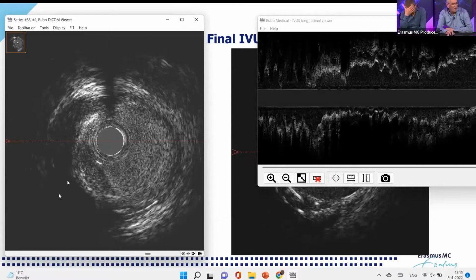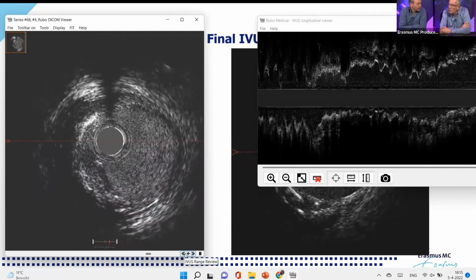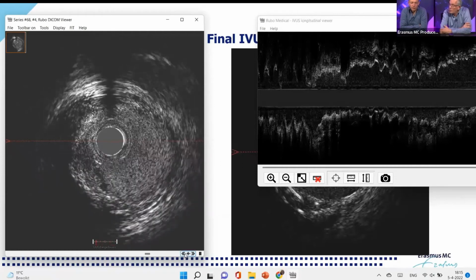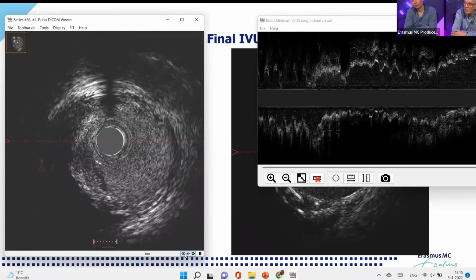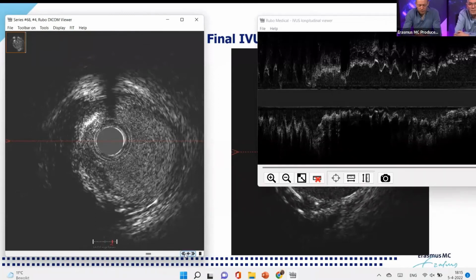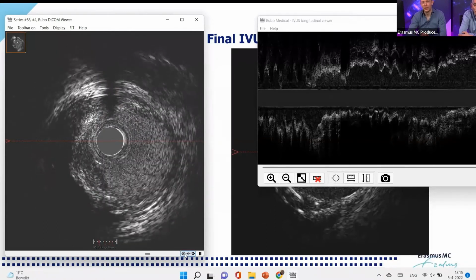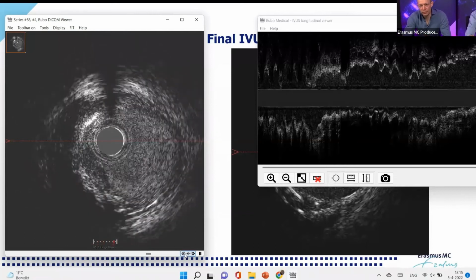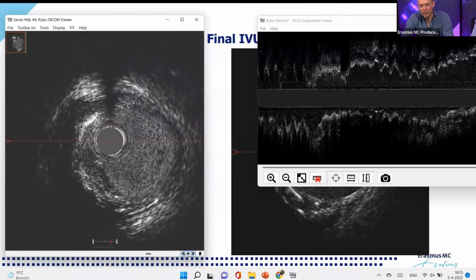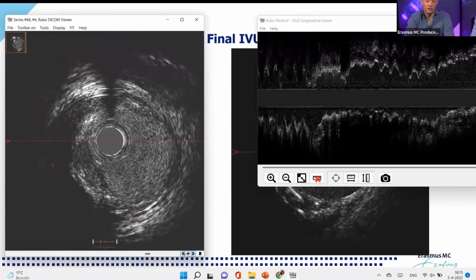So Jurgen, I think you already did some work on that many years ago. We recently redid that with the use of the HD technologies, also with one of our fellows, Frederik Groenland, to look at the appearance of thrombi with IVUS in patients presenting with STEMI, and that was actually quite interesting. So if you are starting to use or build your program on intracoronary imaging, don't be afraid to use these technologies also in patients with STEMI, because there you really will start to appreciate how irregular plaques, acute, subacute, and organized thrombi look. If you take these papers, which we also recently published as a reference document, you will learn how to appreciate these abnormalities.